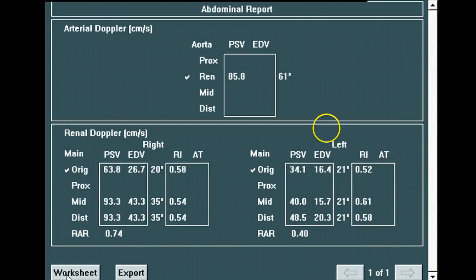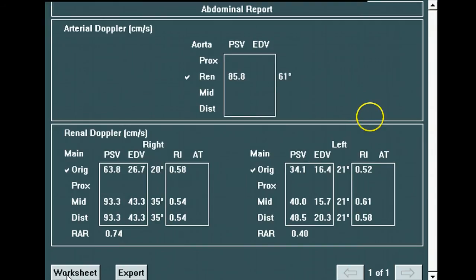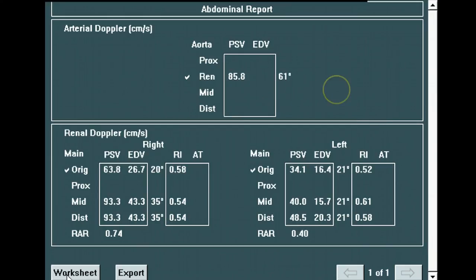In summary, both renal arteries are under 180 centimeters per second, and both have velocities far less than three and a half times the peak systolic aortic velocity. By all velocity standards, this is a normal renal Doppler examination.